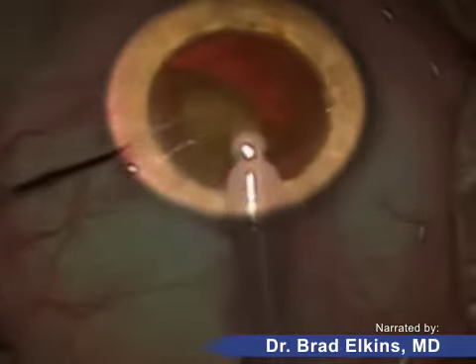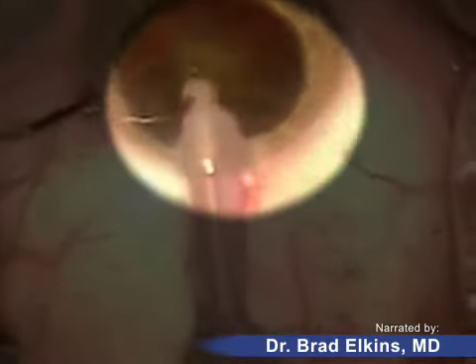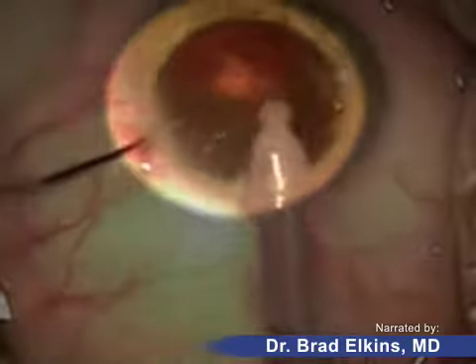Notice how yellowish-brown the lens fragment is. This is what obstructs the light from getting inside the eye and makes the patient's vision blurry.